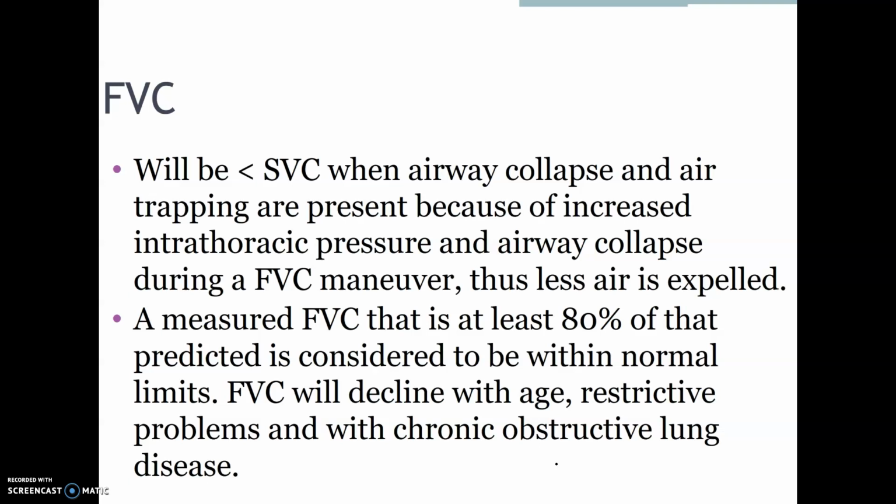A measured forced vital capacity that's at least 80% of that predicted is considered to be within normal limits. And forced vital capacity does decline with age. It will be low in restrictive problems and with chronic obstructive lung disease.